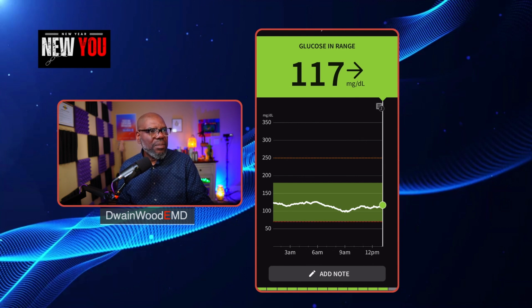Okay. And sometimes people will see that and say, hey, there's something wrong. Well, no, it's nothing wrong. It's just that your blood sugars fluctuate over time. I kind of tell people that's like driving a car. When you get in your car, you start driving, you don't go the same speed the whole time, right? Because, as you're driving down the highway, you have occasions where you slow down, or you speed up, or you move into another lane. All of those movements that you're making are similar to what goes on in the body. The blood sugars rise and they fall.